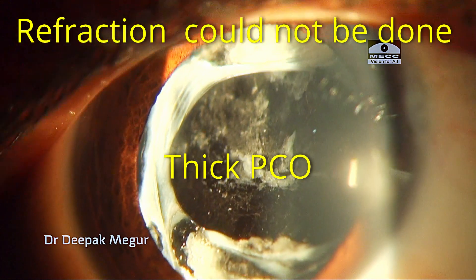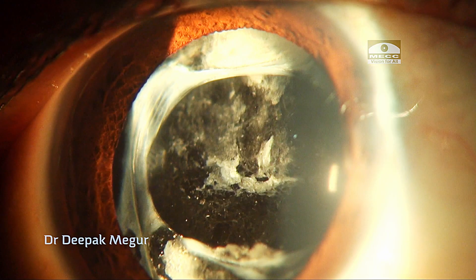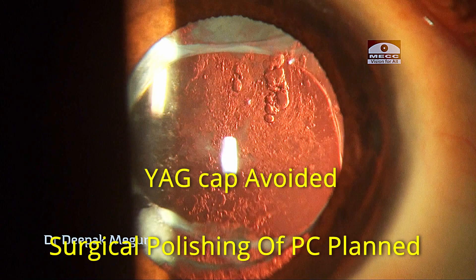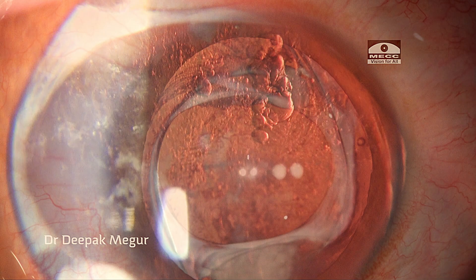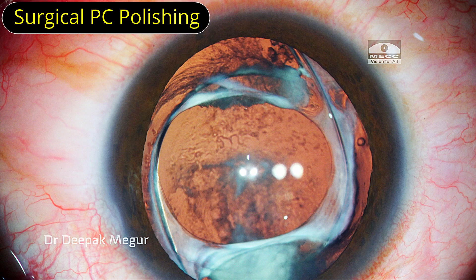His current refraction could not be done owing to a thick PCO. Since this eye was pathologically myopic, I was reluctant to YAG the PCO, owing to my concern about the high risk of him developing retinal detachment later. So I decided to perform surgical posterior capsule polishing. In pathologically myopic eyes with PCO, this is my preferred method of dealing with PCO, especially in eyes which have not developed PVD. So let's begin the surgery.